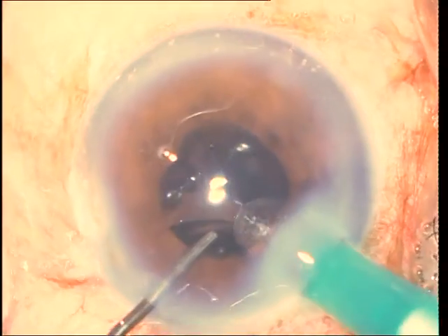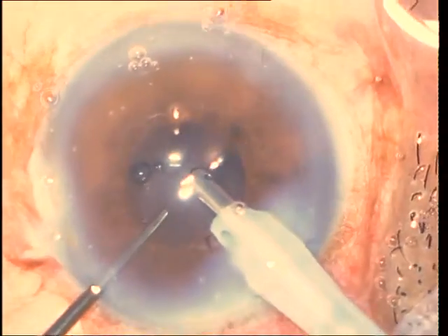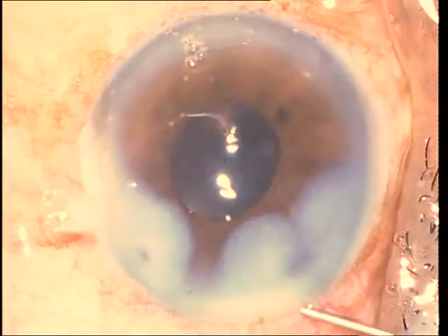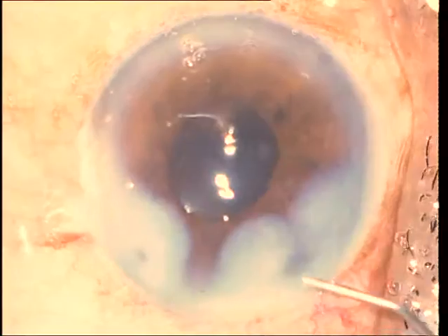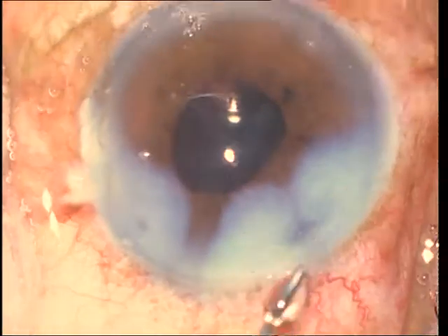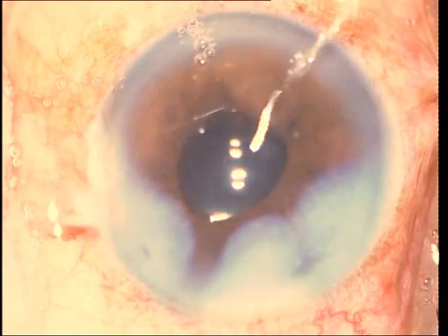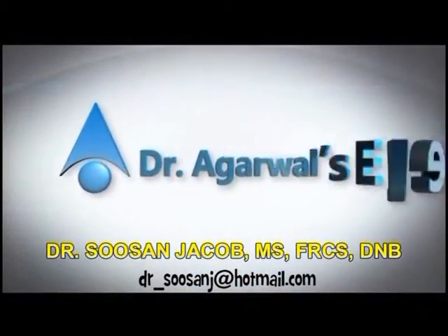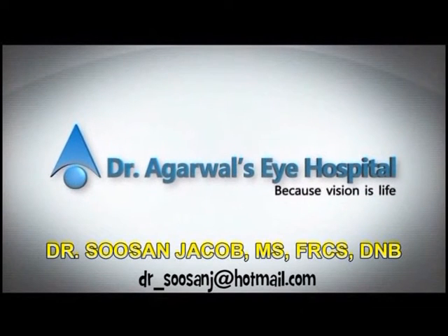With all choppers, it should be made sure that the chopper does not accidentally go above the capsule rhexis rim, where it can cause anterior capsular tears, entangle on the zonules, as well as cause zonulodialysis and other intraoperative complications. To avoid this, the chopper should always be passed below the epinuclear shell to the equator of the nucleus. I hope this video was useful — thank you so much for watching.